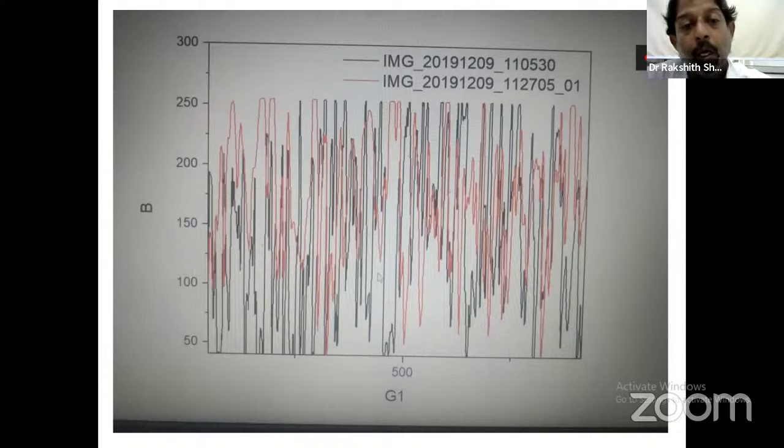Now there are a lot of questions which might run into your mind: when we take a photograph, can we change the direction of the slide and take it in landscape? You take it however you want. We tried all this, subjecting it to different angles also, and the graph showed the same graphic representation. There was no change.